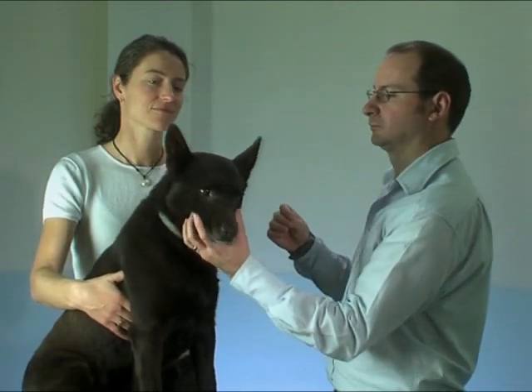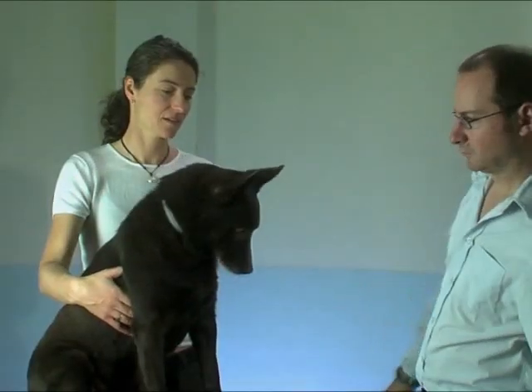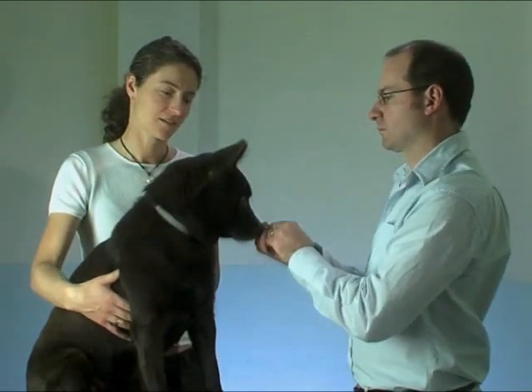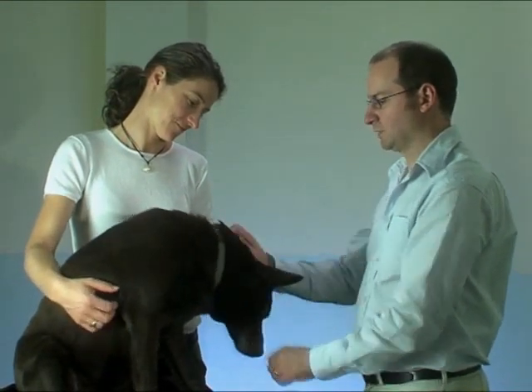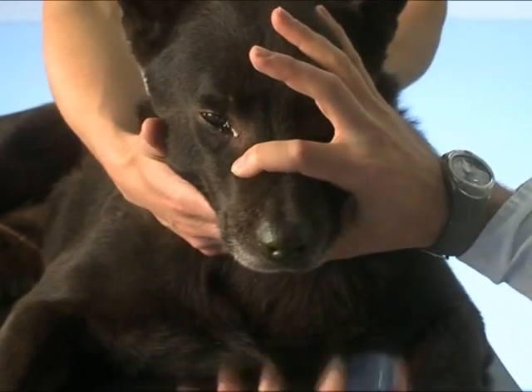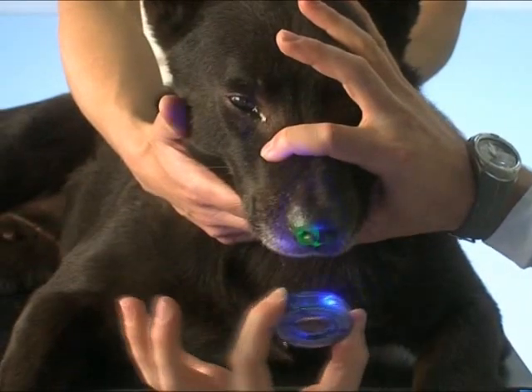Fluorescein is a useful tool for initial assessment of nasolacrimal patency. After applying fluorescein, the head should be lowered to encourage passage of the dye. The nostrils are then observed for the presence of fluorescein. If both eyes are tested together, it is important to be alert for the first appearance of fluorescein at the nostril to avoid confusion due to spreading of the dye to the other side of the nose.